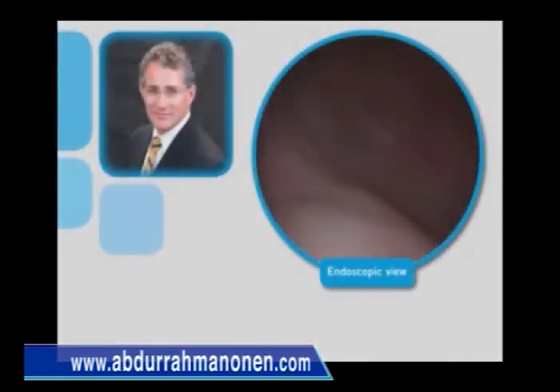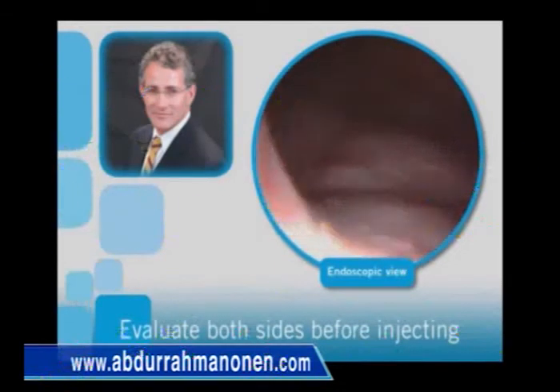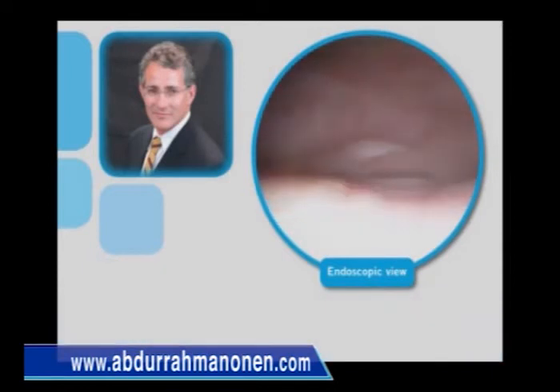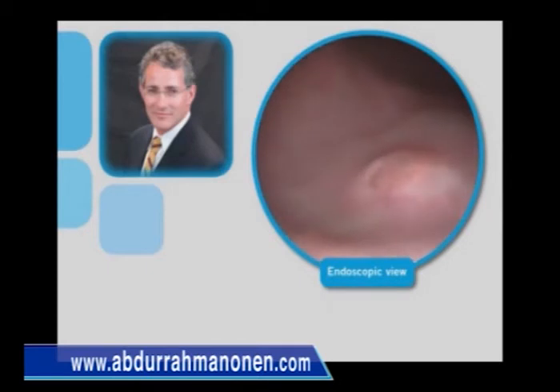Here the ureteral orifice is identified on the right side, and hydrodistension of both ureteral orifices will be conducted as a means of performing a grading. This grading system allows us to determine the approximate volume of deflux injection for optimal coaptation.